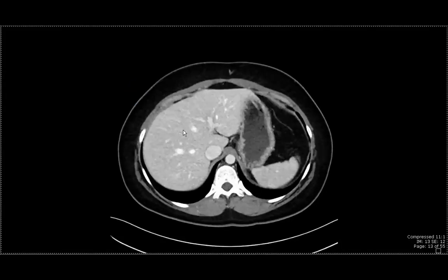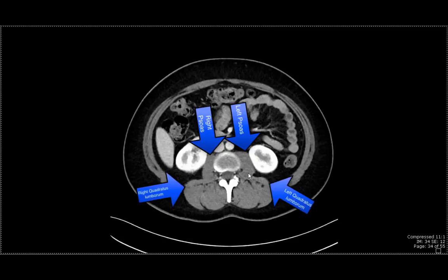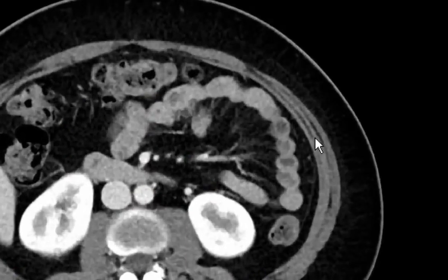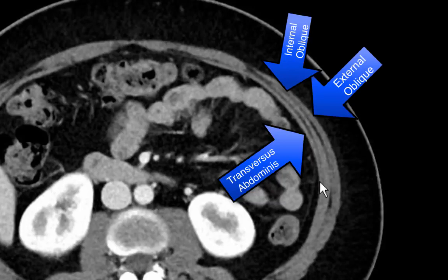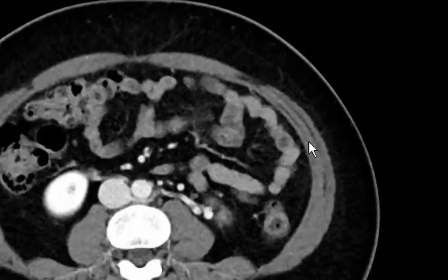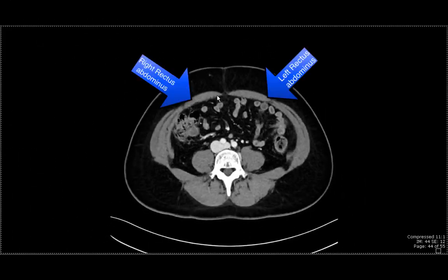I'll also showcase some muscles so everyone's aware where they are. Over here is the psoas muscle on the right side and on the left side. Just posterior to it, lying almost horizontally, is the quadratus lumborum muscle. On this image, you can see the three muscles of the anterior abdominal wall: the outermost muscle is the external oblique muscle, the next one is the internal oblique muscle, and the last one is the transversus abdominis muscle. In the midline, you can see the rectus abdominis muscle meeting centrally at a portion called the linea alba.